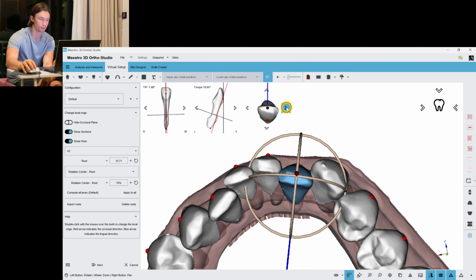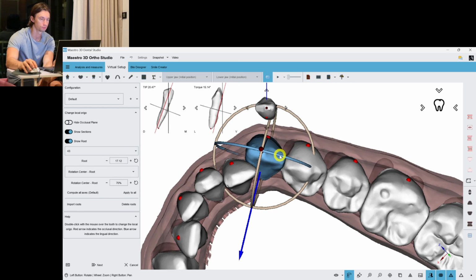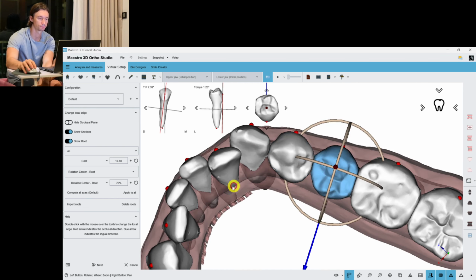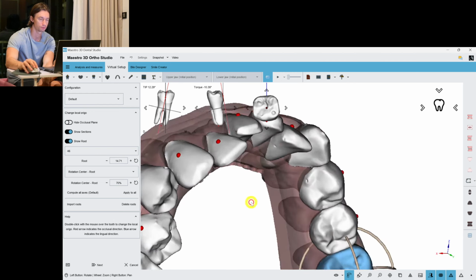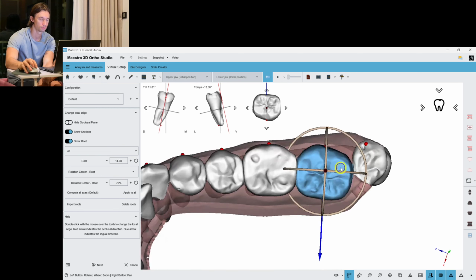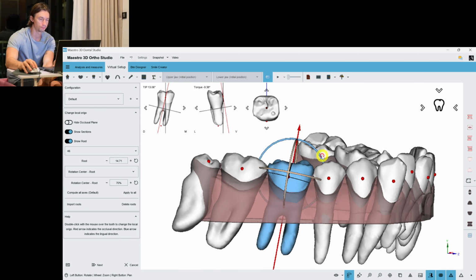And this is the doctor's responsibility to check all the axes, to adjust them, because it affects the treatment planning. That's why it's our responsibility, and we always have to do this.